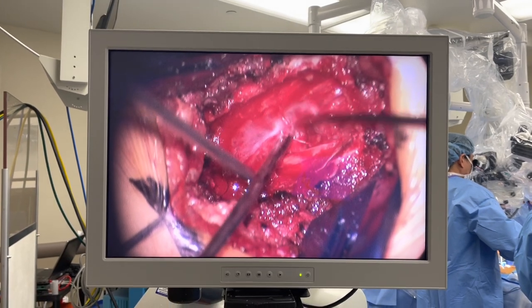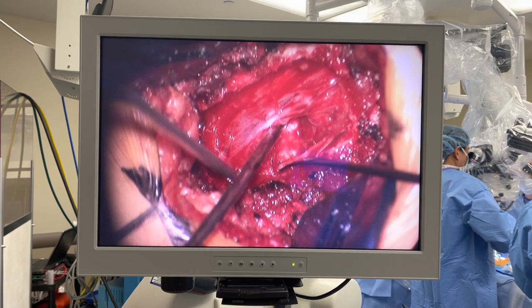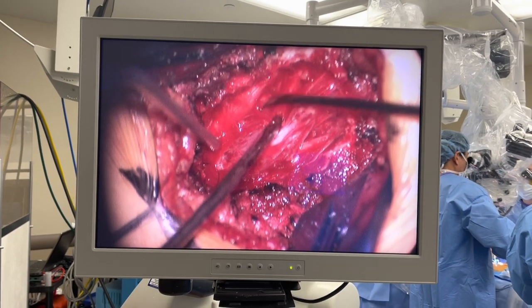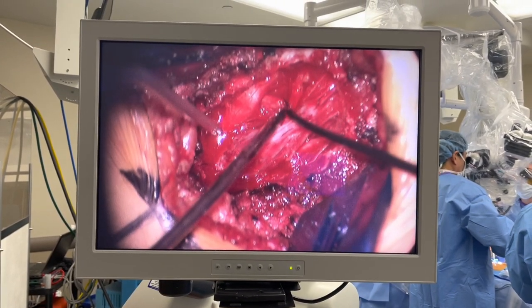Wow. And look at the dural tube. So look at the S3 nerve root. Almost no adhesions. It's just free. But look at this dural tube. It is just stuck circumferentially. Everywhere.